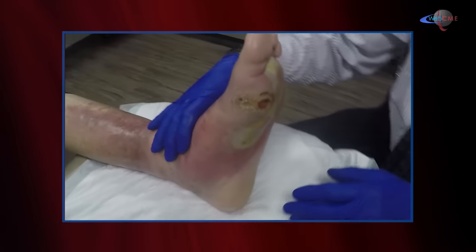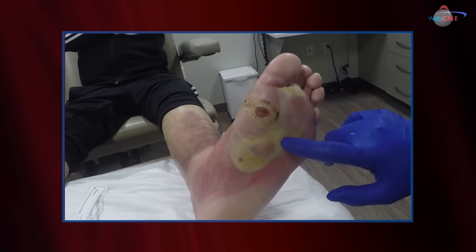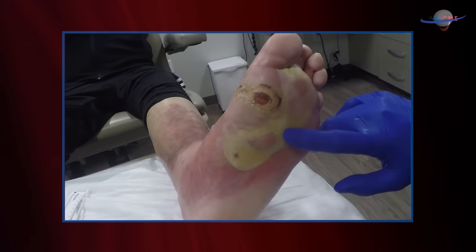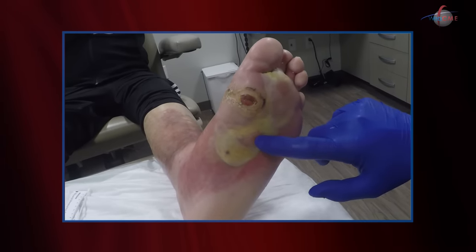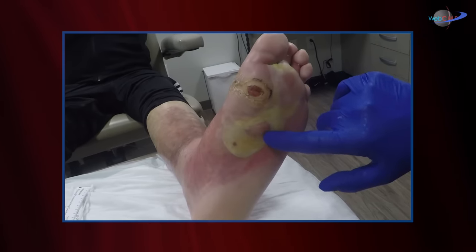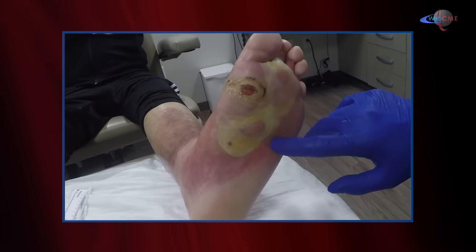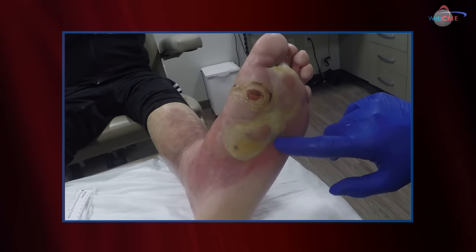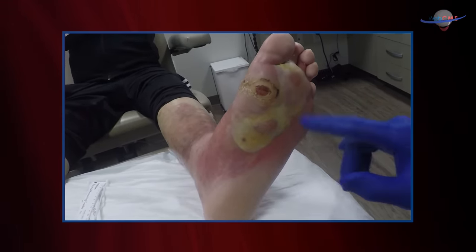What I wanted to illustrate is the plantar findings. You can see the primary ulcer here. There is a fluid-filled blister extending over almost the entire distal plantar surface. This needs to be opened and debrided. This area right here certainly appears soft and mushy. Is this necrotic? Is this an early necrotizing infection? You don't know until you debride it. So we're going to open this area up and see what's hiding underneath. Hopefully this can be managed without surgical intervention, but unless you look, you're not going to know.